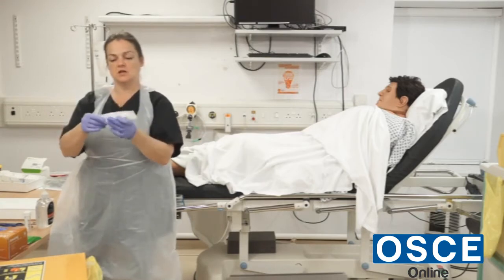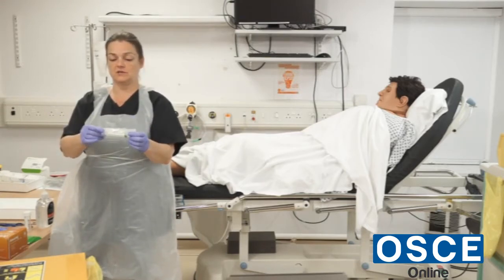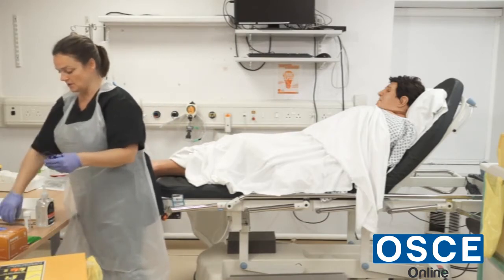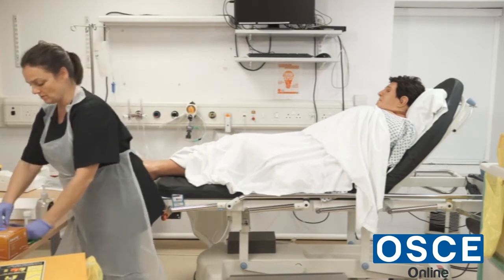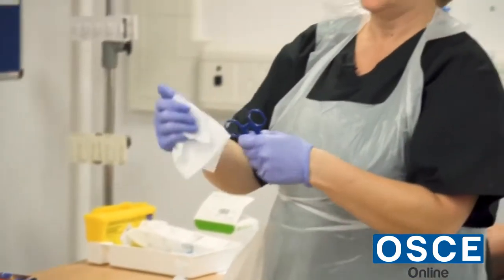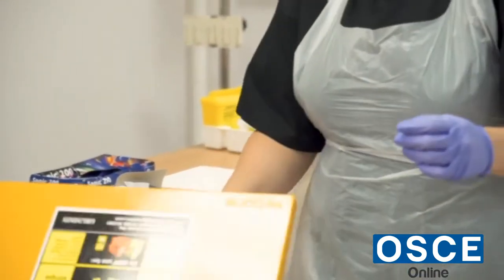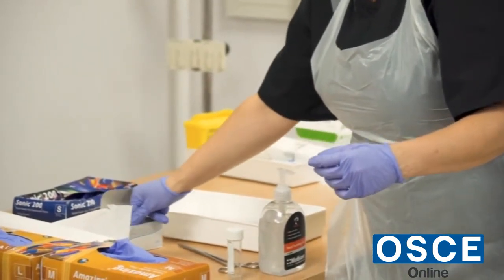The equipment I need would be a 10ml syringe — it's intact and in date till the second of 24. I'm going to need some clamps. There are a couple of pairs of clamps here. I'd give them a quick wipe, choose the clamps I want, give them a quick wipe, and leave them in the tray to dry for 30 seconds.